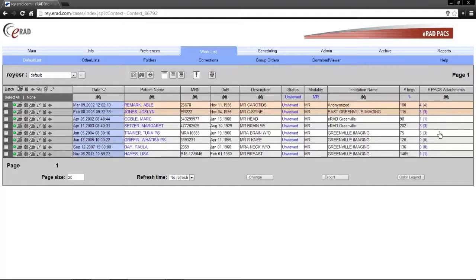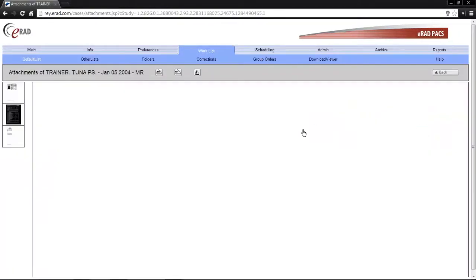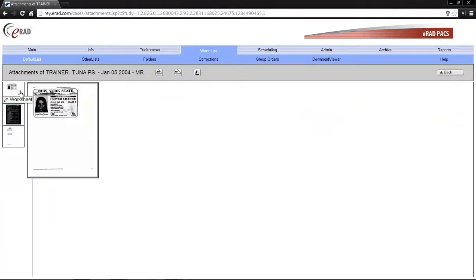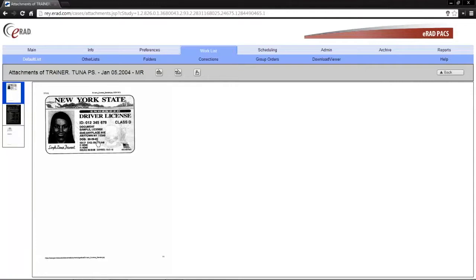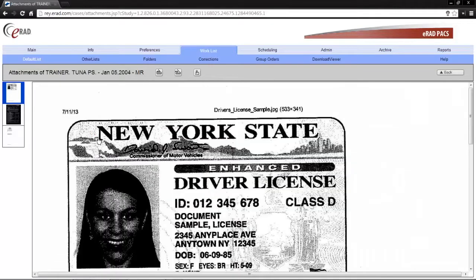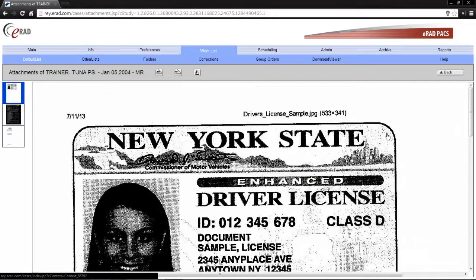You will notice the PACS attachments column has a numerical value which is a hyperlink. If you left click on the hyperlink, you will be brought to another page where you can see small thumbnails. If you mouse over those thumbnails, you will see a slightly larger thumbnail. If you left click on it, you will bring it into the image viewing area. Once in the image viewing area, you can toggle through three different display modes: fit to window, fit to width, and full resolution. This behavior persists wherever scanned documents are able to be viewed.